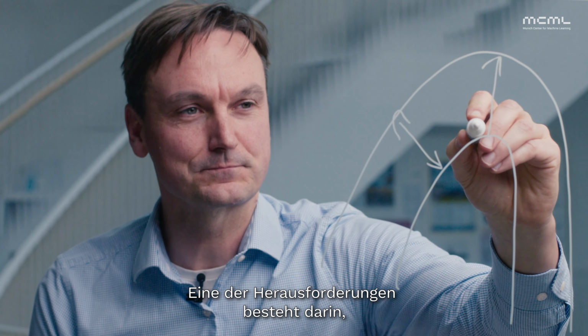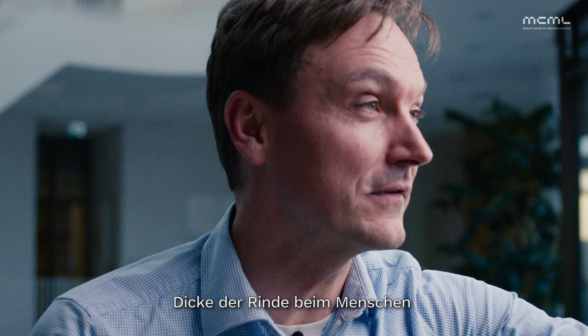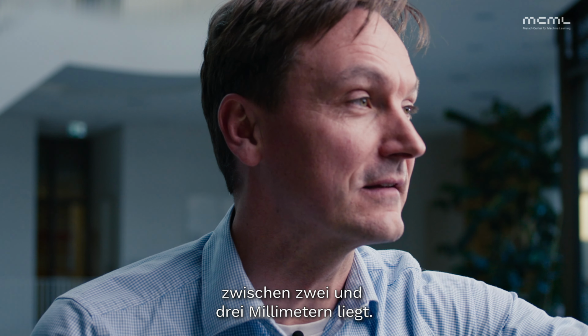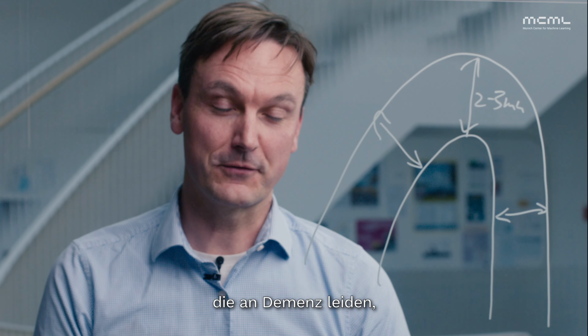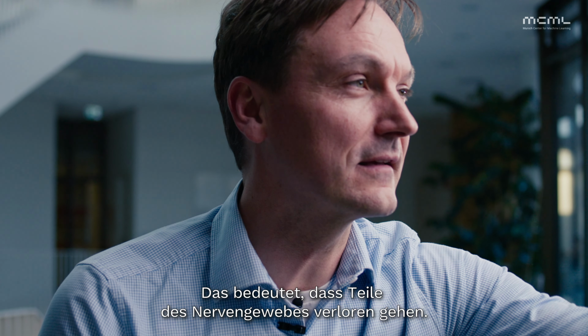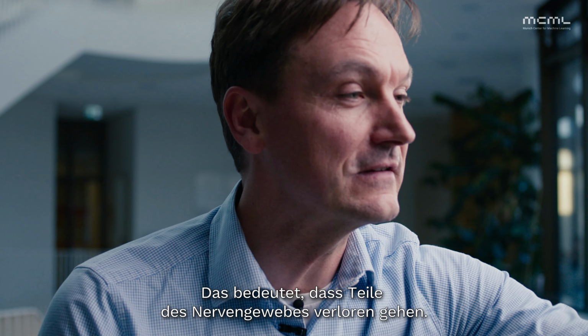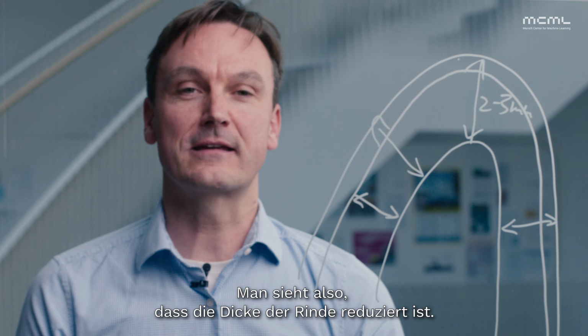One of the challenges is that a typical cortical thickness of a person is between 2 to 3 millimeters. If you have patients that are suffering from, for instance, dementia, the cortex is shrinking. So what is happening here is that some of the neural tissue is lost. So for instance, this would be the surface for a diseased subject. You can see that this is resulting in a lower thickness.